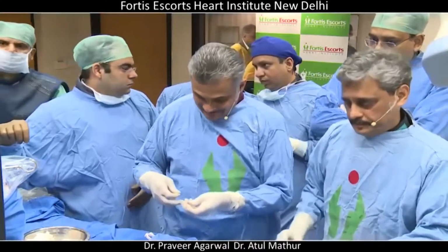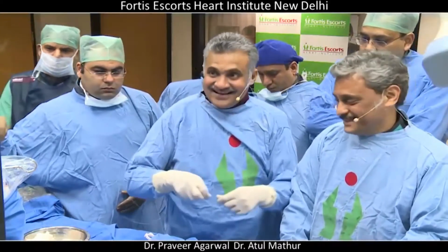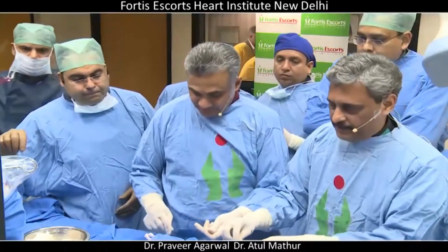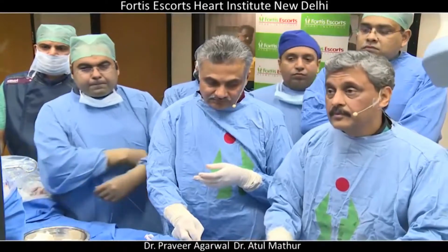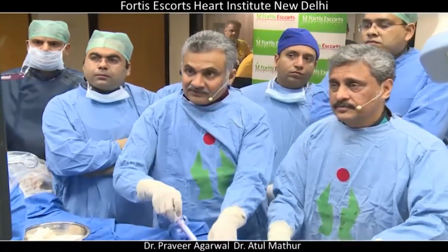So now this is 2.5 going in the main vessel. So it looks like you also avoided the V stenting, because now you touched the proximal circumflex, right? You pre-dilated, yeah. Now we decided to touch it, yes, we have done that, because that was the area where there was resistance, you know. Yeah, we all agree.